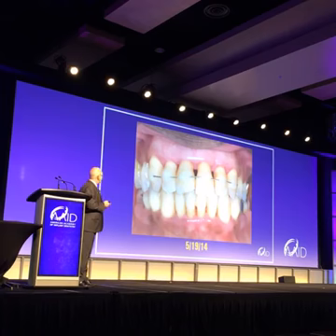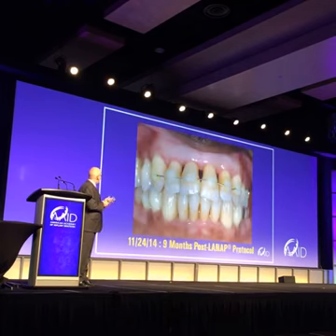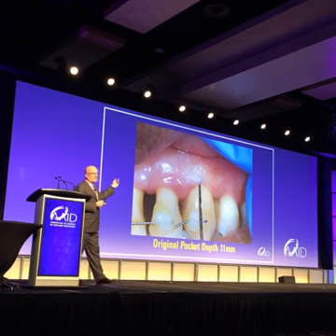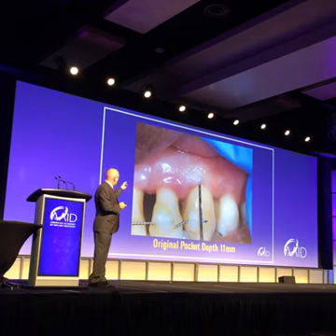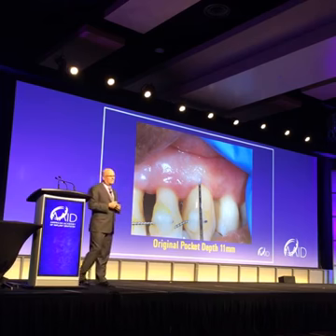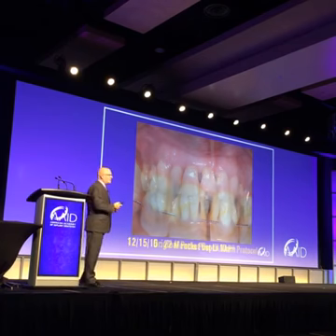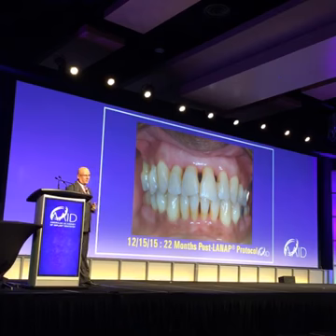Here he is 6 months later. There's actually 3 months after we did treatment. Here's 9 months. And it's looking good. Tissue staying nice and pink and healthy. The original pocket depth on this was 11. And look, I didn't have to cut away 9 millimeters of tissue to get a 2 millimeter pocket. And this original pocket depth was 10, and now it's a 4. Again, without cutting away tissue. Saving the patient's teeth, getting a new attachment to occur.